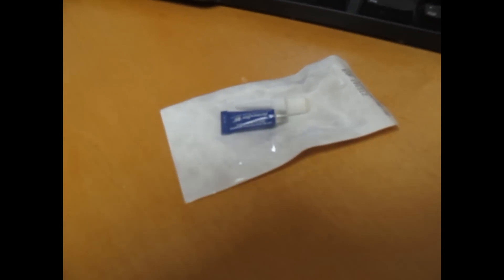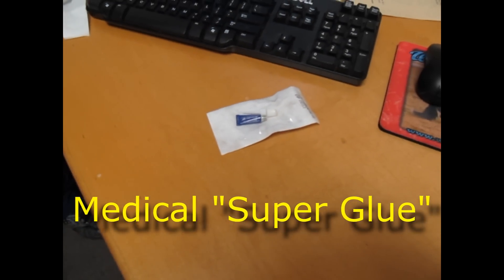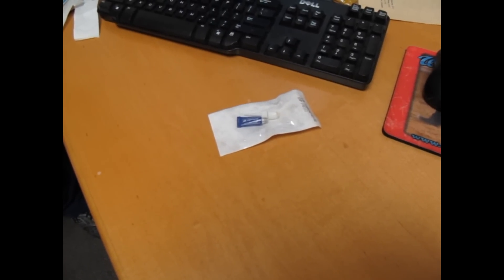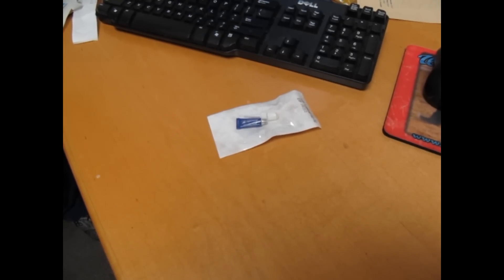Today we're going to do a little experiment. This is Dermabond. Dermabond is sometimes used to try and get foreign bodies out of ears. We're going to see how this works as far as hooking up to a Q-tip and on plastic.